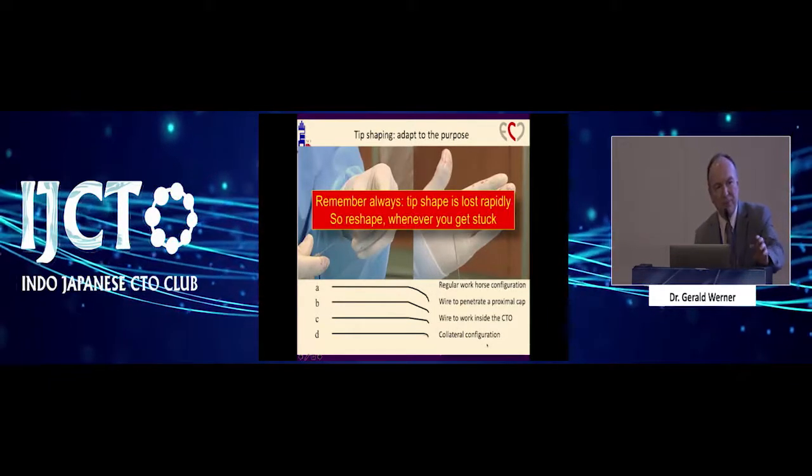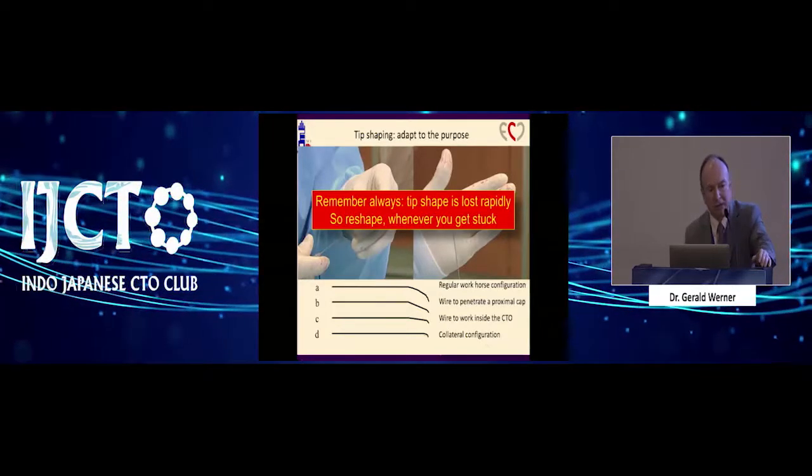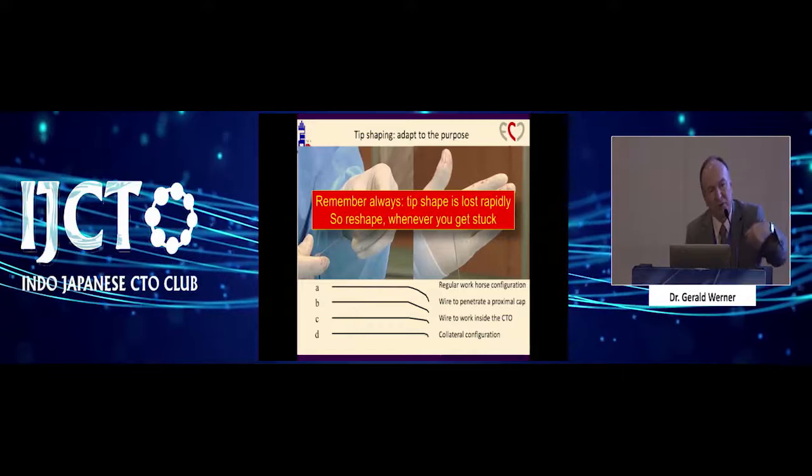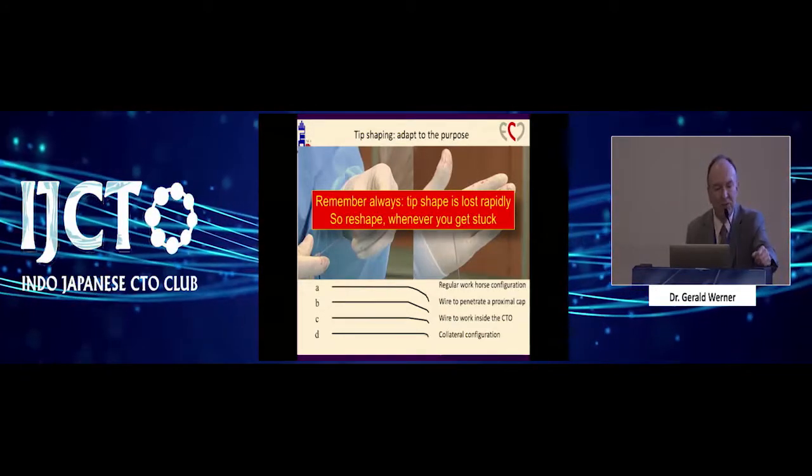But remember, most of the older wires, Confianzas, Miracles, they lose the shape within a few minutes. So you need to reshape, get the wire out, reshape if you get stuck.